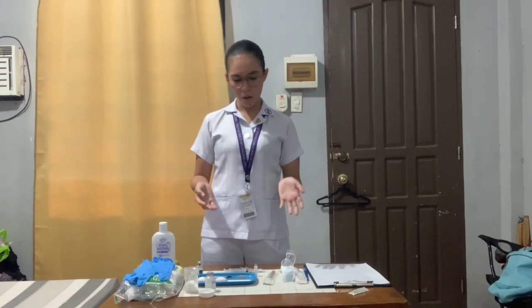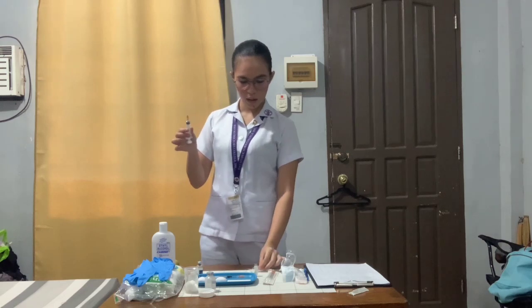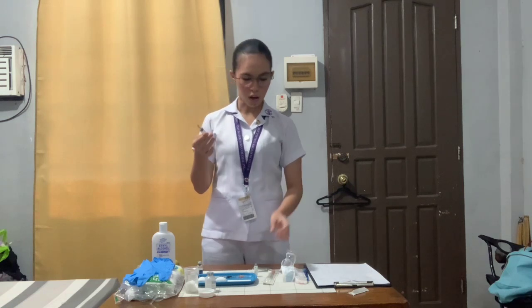We are now going to proceed in withdrawing the medication. Now we are going to remove the cap of the filter needle. Now we are going to insert the needle into the center of the ampule. So we have to make sure that we are not touching the rim of the ampule with the needle tip or shaft.